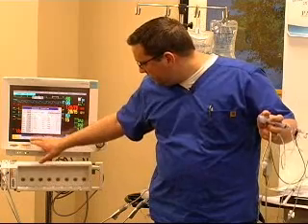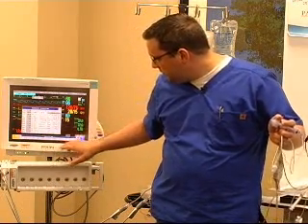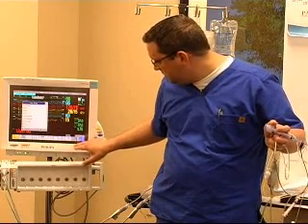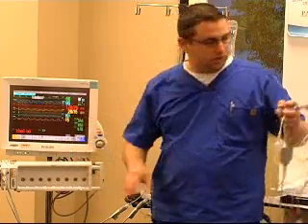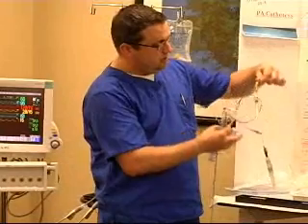So now that all that's in there, we're going to perform calculation. And that's going to give us our numbers with the cardiac output and index. Okay? All right, so any questions about cardiac output? That would be where we're next. We're going to go to obtaining a wedge.